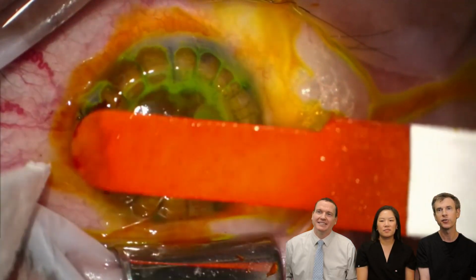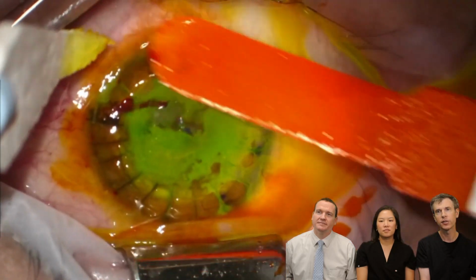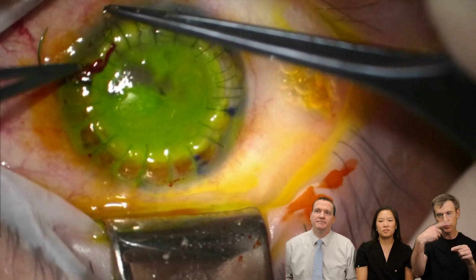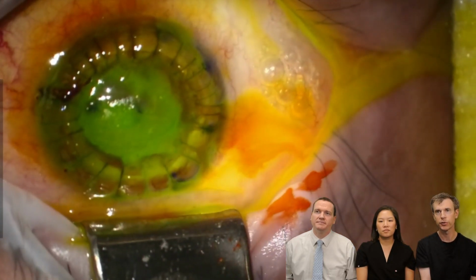It was 9 millimeter. It's a good evidence of a suture leak, by the way. On the bottom there, you can see it. The orange immediately goes lighter, and this is the wound is not quite secure, so more sutures are placed in that area. But suture leaks, which happen around the suture, tend to close within a day, so I'm not worrying too much about it. But a wound leak, when the wound is not secure, that usually warrants more sutures.